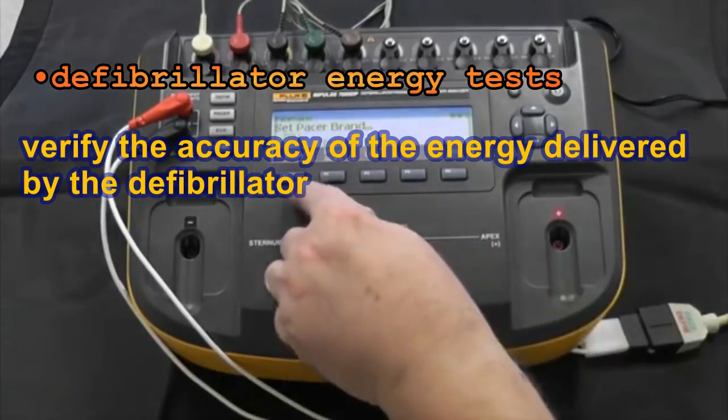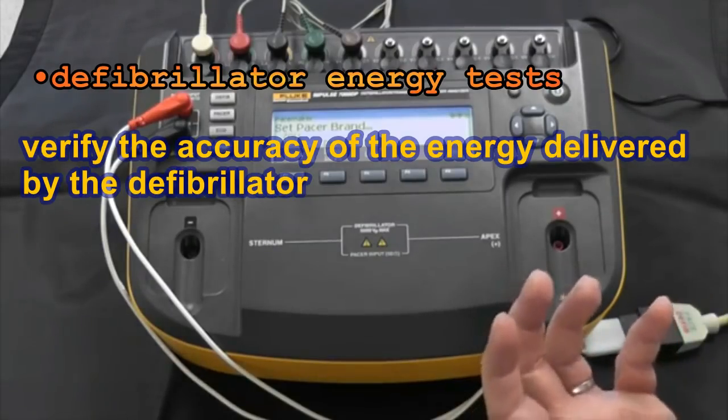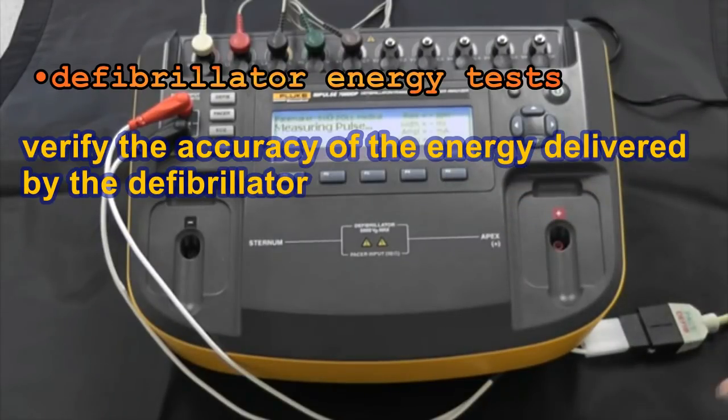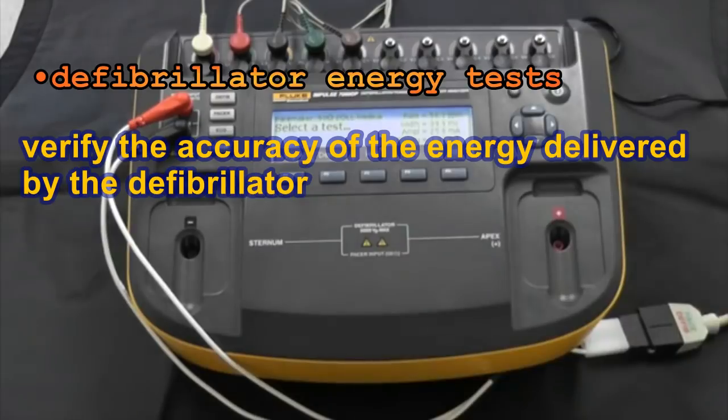Now that we've selected the brand, we have already selected internally to the Impulse 7000 the load appropriate for that brand. We also tell the Impulse 7000 that we're using the pacer posts and then pick done. Now we're ready to receive energy from the pacemaker. These are all of the pacer parameters we would test. In addition to those, there are other tests required by international standards and possibly by the manufacturer — asynchronous tests, demand mode tests, and a few more depending on manufacturer requirements.